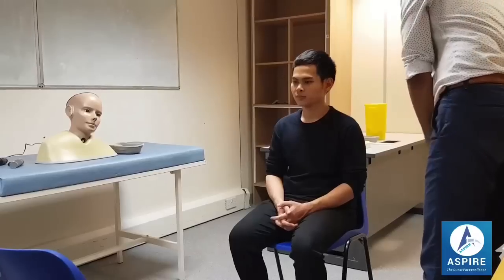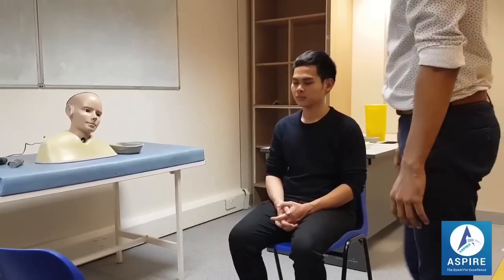There's no redness, no bleeding, no discharge, no foreign body, no battle sign in both the ears. Now I'll be touching your ear.